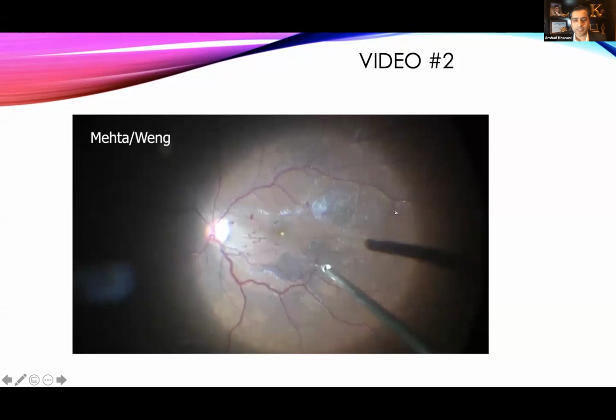So Mitul, another great question from Alexander. Does blue stain PVR well like ICG? Sometimes it feels like it even stains vitreous. Can you guys speak to all the things you can stain that aren't ILM? So he's basically asking what is your experience in PVR using Tissueblue? Yeah, so I find with PVR, it doesn't actually stain it as much as it gets stuck in the folds of the PVR, which identifies it, which is nice as well, but it really does stain the ILM around it. So I like to use it in those cases because we really don't want to get ICG underneath the retina and detached retina.